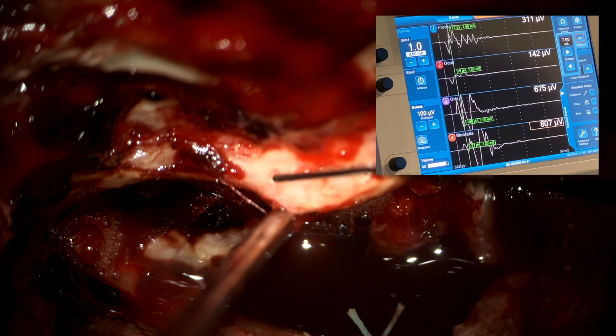Leave it right there. We stop talking for a second. You hear that? That's sub-threshold activation. So the system taps, it tells you it is recording and recognizing an action potential, but it's below 100 microvolts. So I want to put the stimulator down to 0.1.